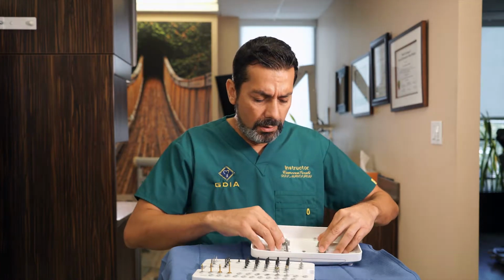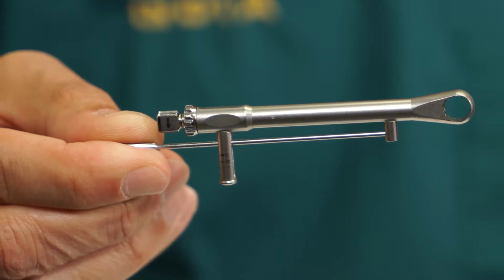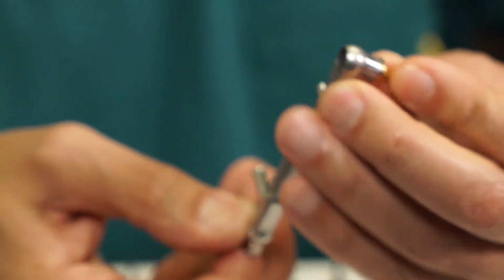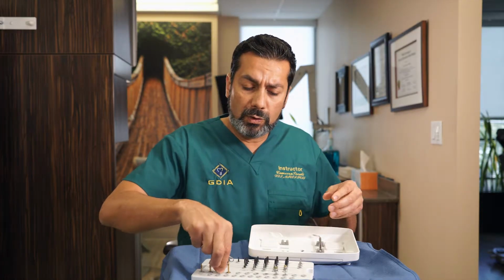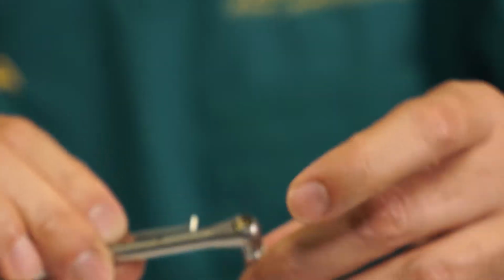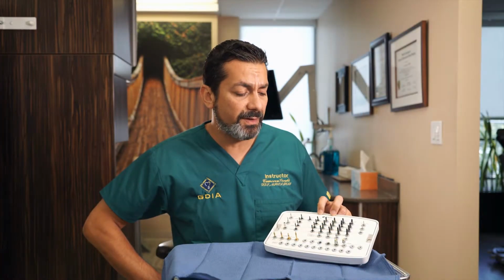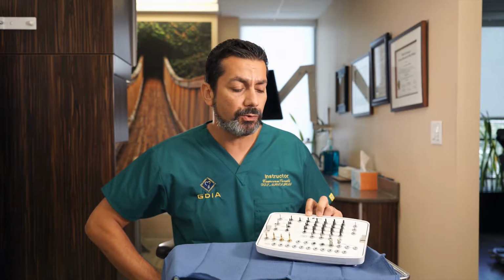And your torque wrench can be used on the back of your implant driver when you want to measure the torque of your implant. It can also be used for your abutment driver, and you can torque in your abutment at a desired torque. S-Clean system is very easy to use, and later on in clinic we're going to show you how it's done on live patients.